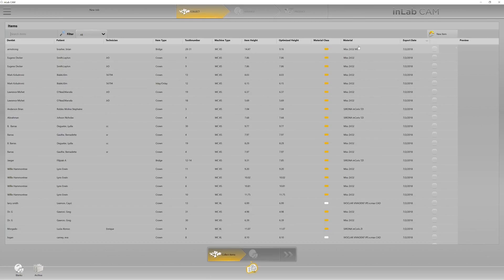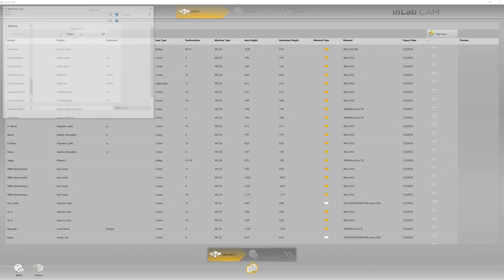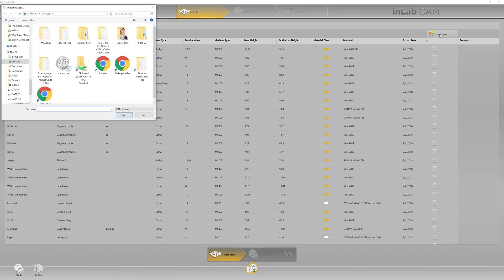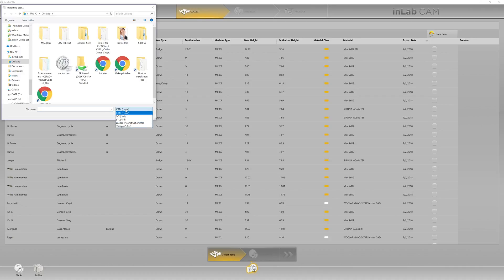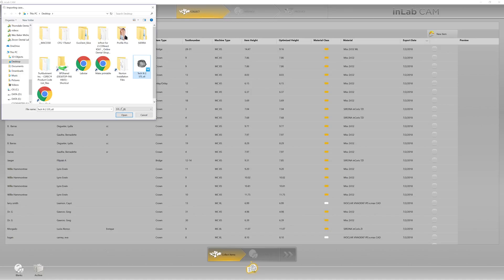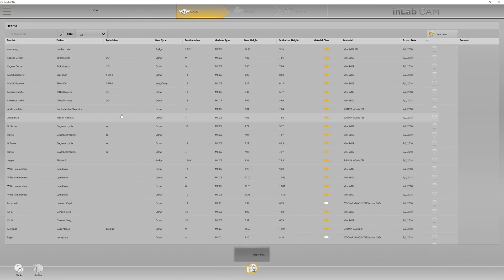Then we're going to go to new item in the upper right hand corner of our item list. Notice that I do not see an STL file here on my desktop because it is designated looking for CAM files. I go down here to look for my STL. Right there it is and I hit open.